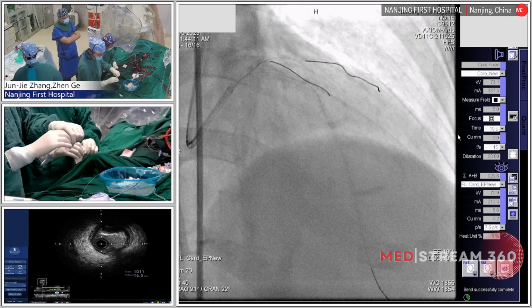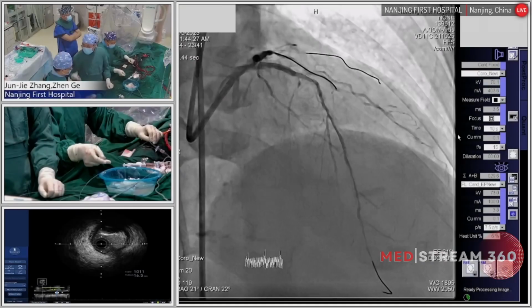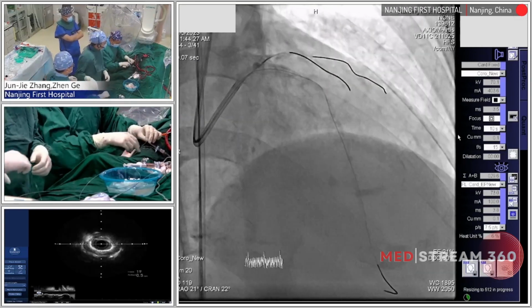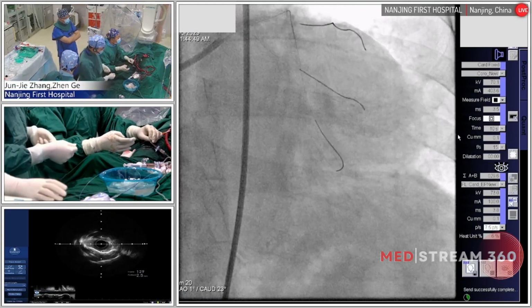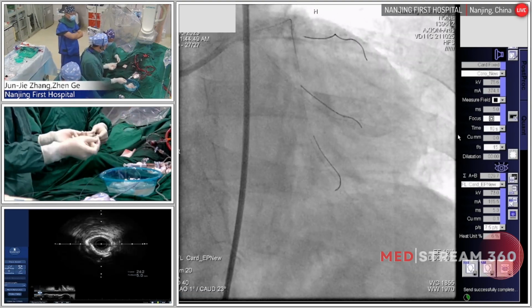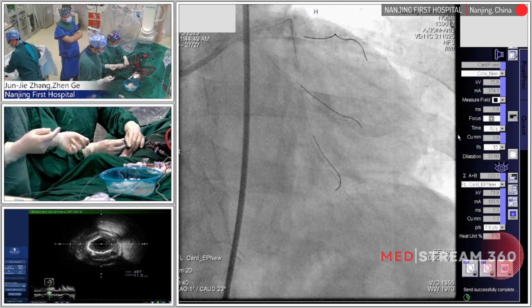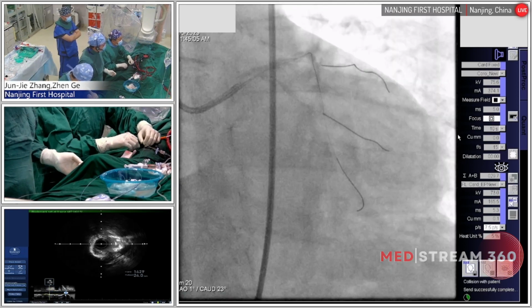Yes. Then we will switch to the distal left main with the DK crush stent. So next step is the DK crush. The first step, side branch stenting. According to the IVUS imaging, we selected the 3.0 by 18 stent for the circumflex with minimal protruding into left main. At the same time, I think we will choose a 3.5 balloon put into the LAD, which will be used to crush the circumflex stent.